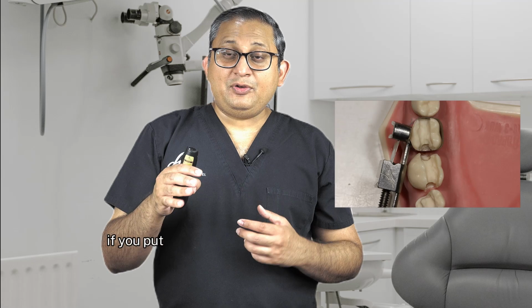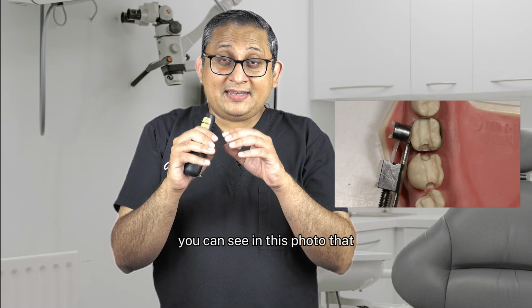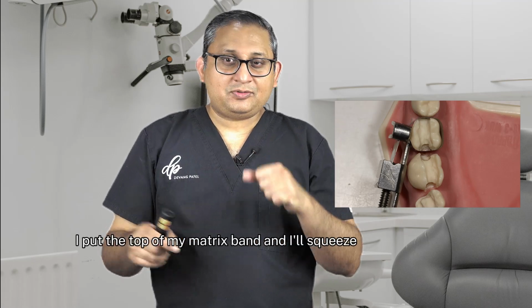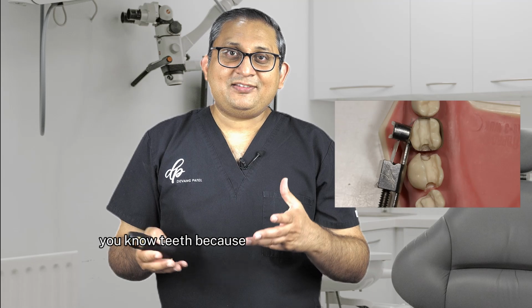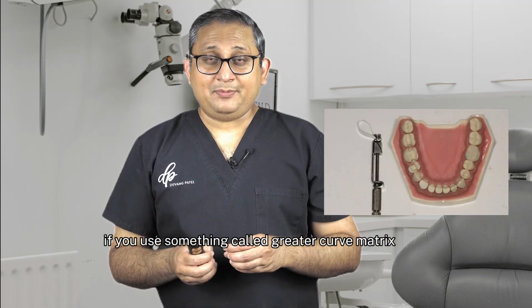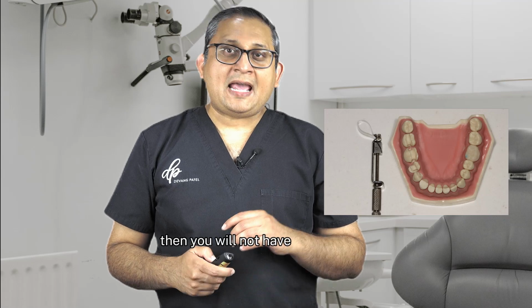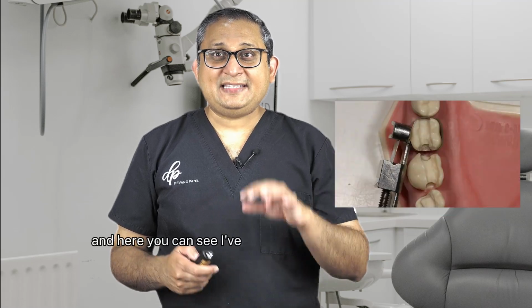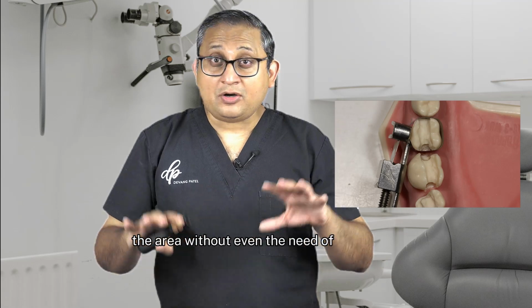However, as I can show you here, if you put it without cutting the band, you will see a gap. You can see in this photo that I put the Tofflemire matrix band and I've squeezed really tight, hard, and this is a typodont, arguably the easier teeth, because you can push this subgingivally. Even then you can see a tiny gap. However, if you use something called a greater curve matrix band or greater curvature band, then you will not have that problem. And here you can see I've used a greater curve matrix band, and that has perfectly sealed the area without even the need of the wedge.